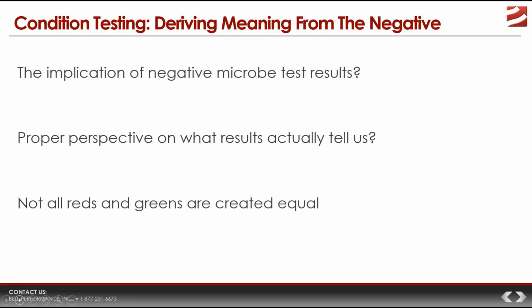But we have to remember, though, that this is total microbe count. If you've got 100, that doesn't mean it's 100 problematic. It's just total microbes. So we have to acknowledge that possibility, but we don't really have a way to find out anything more specific than that. So that basically means we have to acknowledge that that's true, but that doesn't entail that there's anything else specific that we can or should do about that. So that is a brief consideration of the testing options that we have available.